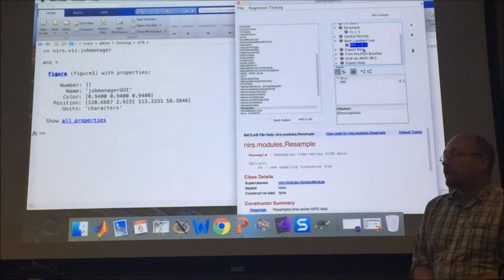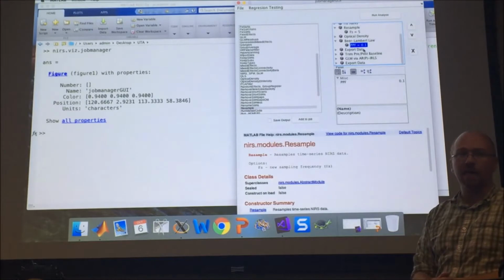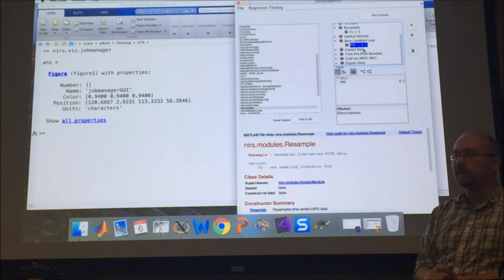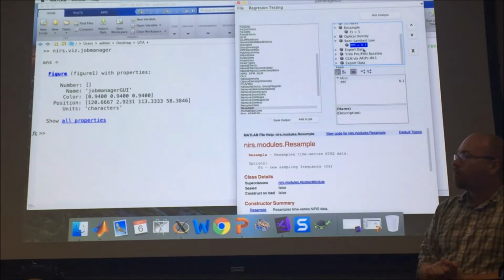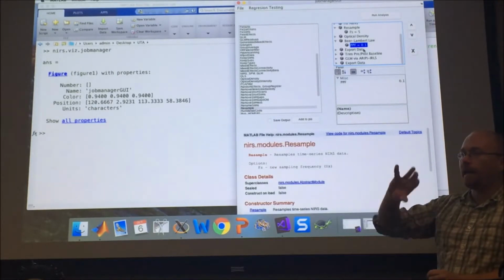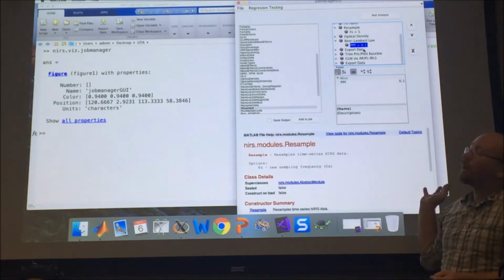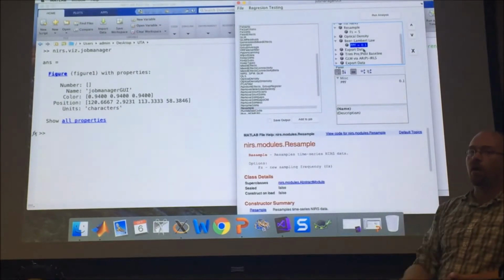PPF of 0.1 is a differential path length factor of 6 and a partial volume term of 60, which are kind of the numbers that came out of one of these Gary Strangman papers that looked at what DPF was in simulations and so on. But that PPF is accounting for both the path length, the fact that it traveled a long distance through the tissue, and that of that path length, only a small fraction was actually spent in the brain. If I get that number wrong, it's just scaling my overall responses, and that number of 5 micromolar hemoglobin change is dependent on that number.